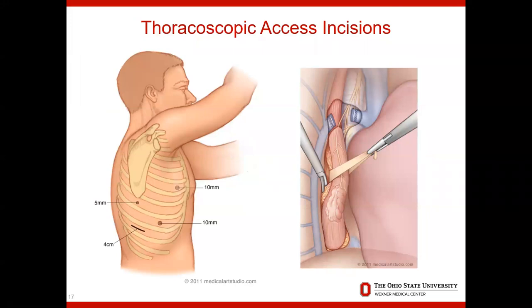The thoracoscopic access incisions for the thoracoscopic portion of the operation are very small — 10 millimeters to 5 millimeters — with a 4 centimeter access incision to allow specimen removal. During the thoracoscopic portion, the esophagus is detached from all connections within the thoracic cavity for full mobility. The tumor is located and the esophagus is divided with at least a 5 to 6 centimeter margin to lower the chances of local recurrence at the reconstruction site.